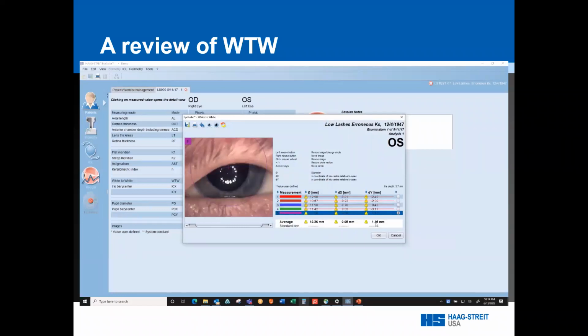This was the result of a simple technique that you may already be aware of. When you have a Lenstar with APS, after the initial focus alignment, the Lenstar takes over and drives on its own. Being hands-free will allow you to assist a difficult patient. In the following slide, I have a brief video to demonstrate a technique that you might find extremely helpful.